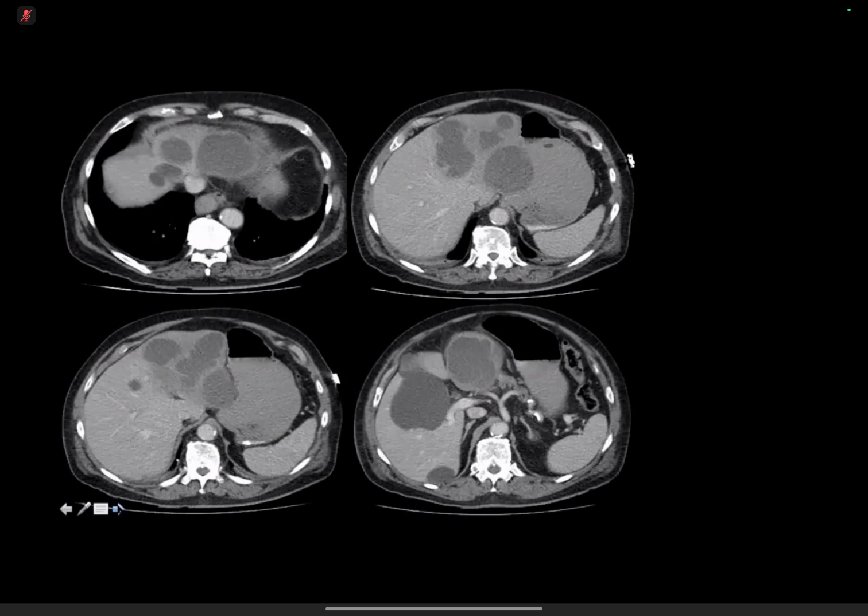So I perform the procedure under ultrasound guidance with informed consent from the patient, and after checking that they're suitable in terms of coagulation and similar factors, I would use local anesthetic to numb the skin, and then essentially I have two options. I could either use a single puncture technique or a Seldinger technique, but either way I would access the lesion with a needle and then pass over that a pigtail drain, which I would then aspirate as much pus, if we presume these abscesses, as possible before securing the drain.